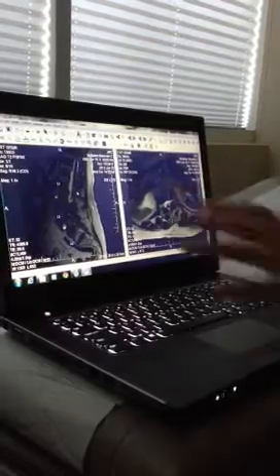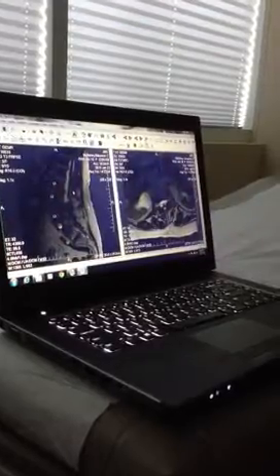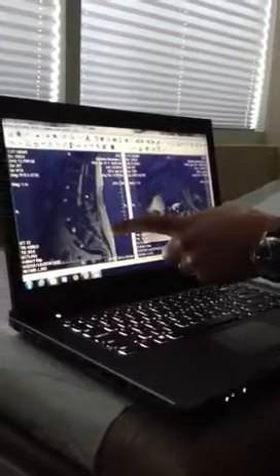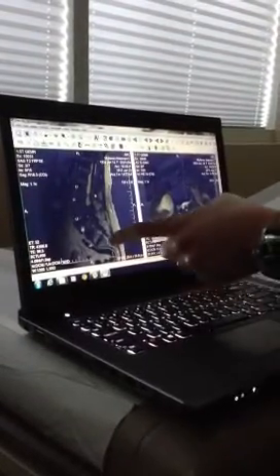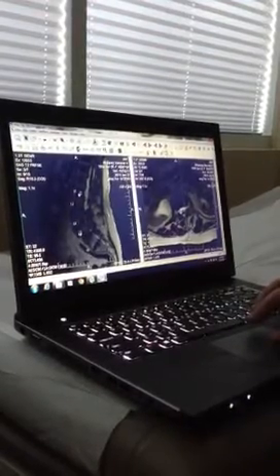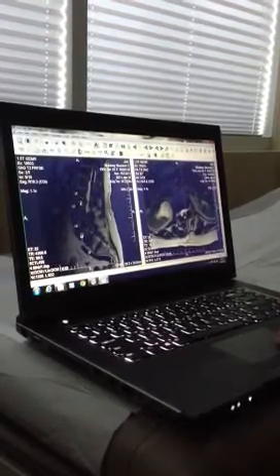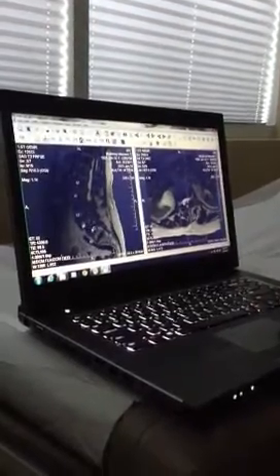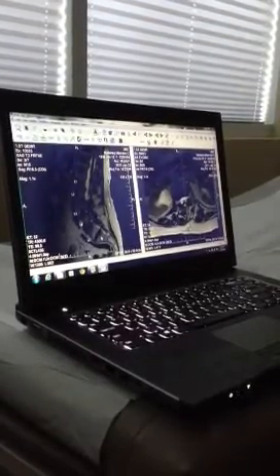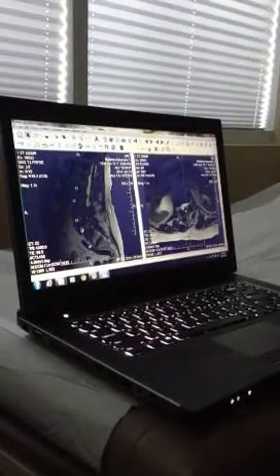this, okay? So this is a one-dimensional view where your abdomen is over here. This is anterior, so this would be where the front section is. And this is the back, your spine over here, okay? This is where your tailbone begins, okay? We have 5 bones in our spine in the low back. It's called lumbar, and they're labeled lumbar 1, lumbar 2, 3, 4, 5, and then we hit what's called S1, which stands for sacrum, the beginning of our tailbone. Sacrum eventually terminates in what's called the coccyx, okay?